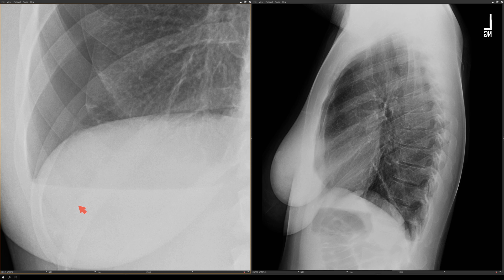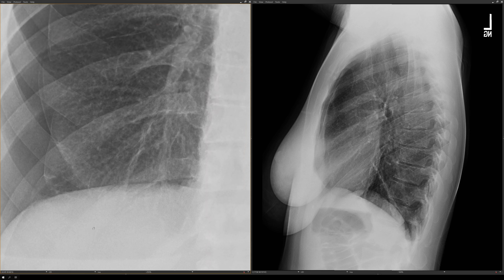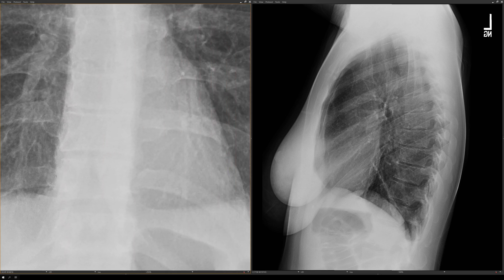If it were just a simple pleural effusion rather than a horizontal line, you'd see a meniscus, because the fluid would be creeping up the side between the lung and the pleura. Because of the patient demographics and the hydropneumothorax, I'm going to be very suspicious for LAM — and this is probably a chylous pleural effusion. Even looking very critically at the lung, I don't think I would call anything in this patient.